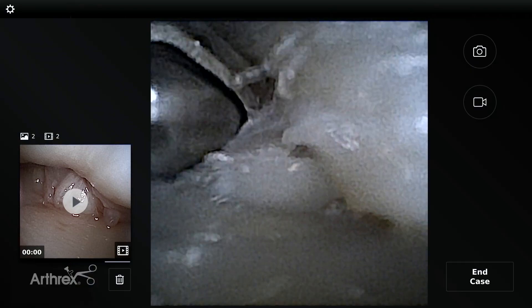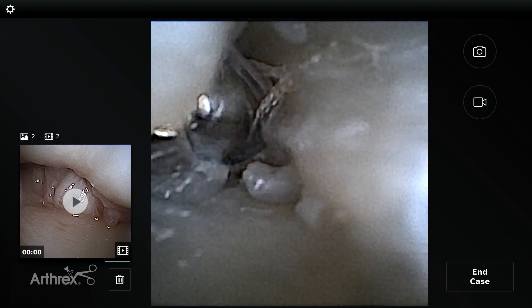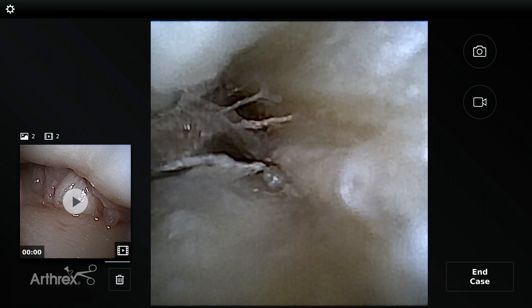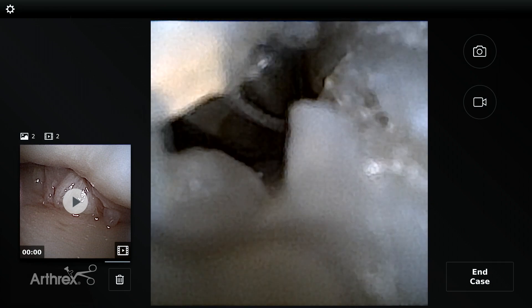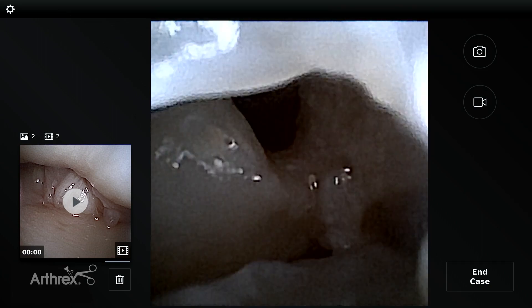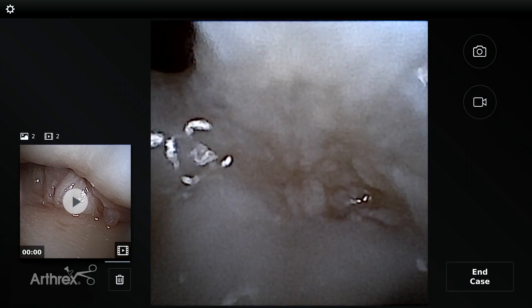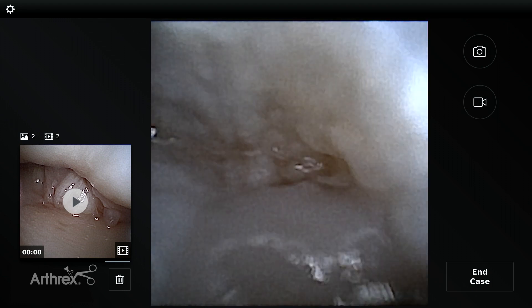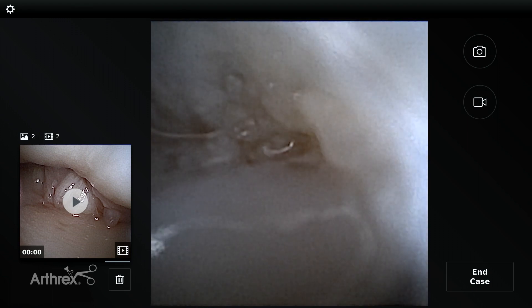Now in the DRUJ arthroscopy, we've taken the small joint shaver — the 1.9 — and you can see we're above the ulnar head, cleaning out some space underneath the TFCC. We want to see the foveal insertion to ensure that it is stable. It's a tight space, but the advantage of the nanoscope is that it allows us to see in these tight spaces. We've completed our DRUJ arthroscopic synovectomy. Coming from radial underneath the TFCC, you can now see the foveal insertion of the TFCC is intact — you can see the ulnar curtain essentially inserting into the fovea.